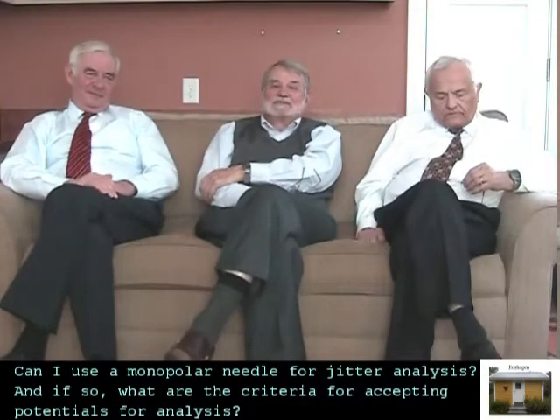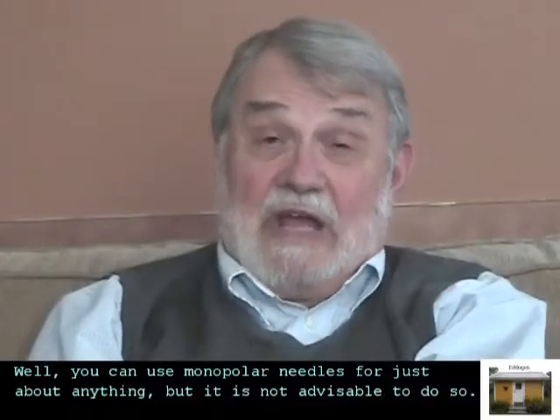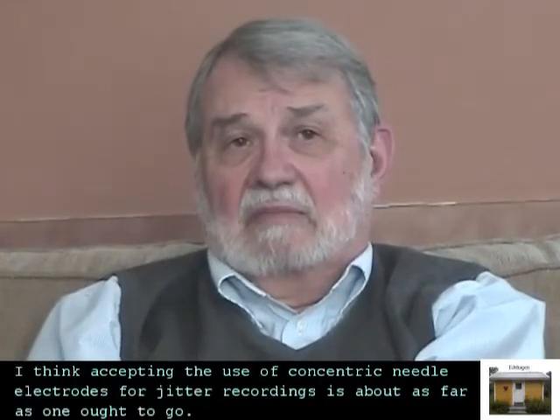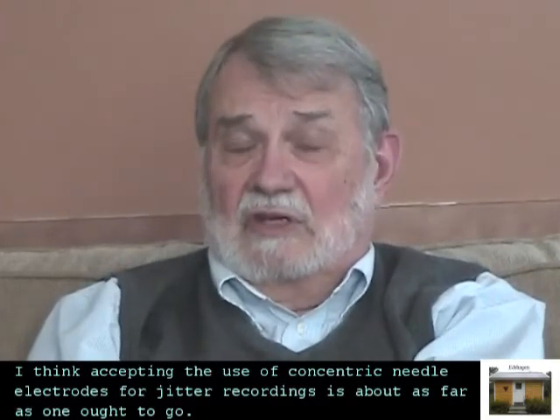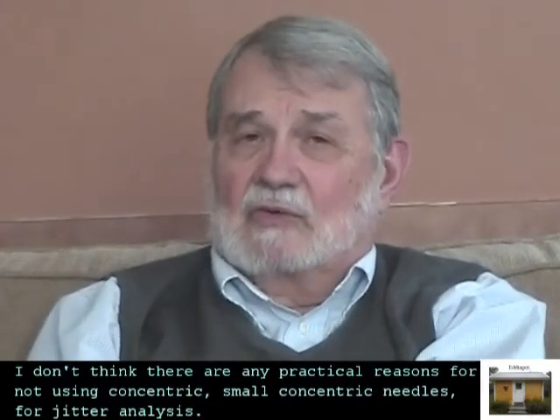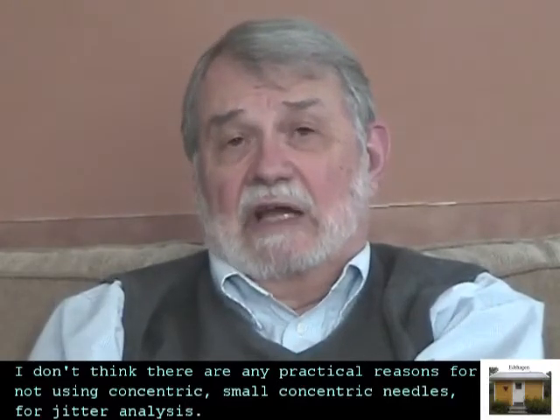Can I use a monopolar needle for jitter analysis? And if so, what are the criteria for accepting potentials for analysis? Well, you can use monopolar needles for just about anything, but it's not advisable to do so. I think accepting the use of concentric needle electrodes for jitter recordings is about as far as one ought to go. And I don't think there are any practical reasons for not using small concentric needles for jitter analysis.